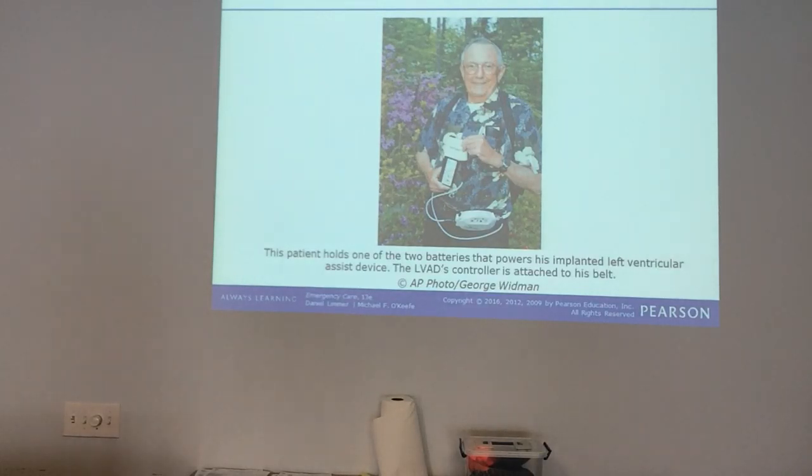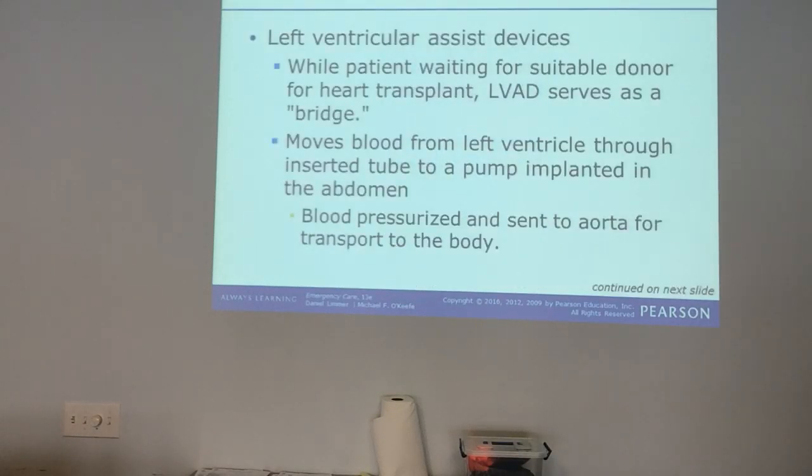LVADs, left ventricular assist devices. This patient's holding a battery that keeps his heart pumping pretty much, okay? And the LVAD controller is there in his belt. While the patient is waiting for a suitable donor for a heart transplant, the LVAD serves as a bridge. It serves as a bridge to one of two things. It serves as a bridge to life through a heart transplant, or it serves as a bridge to death, okay? Eventually, if they don't get a heart transplant or aren't suitable for a heart transplant, it extends their years until they do die.